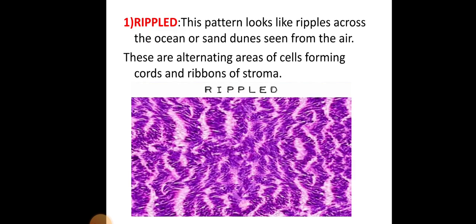The first pattern is the ripple pattern, where the pattern looks like ripples across the ocean or sand dunes seen from the air. These are alternating areas of cells forming cords and ribbons within the stroma.